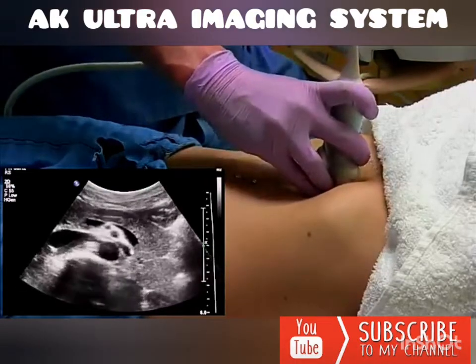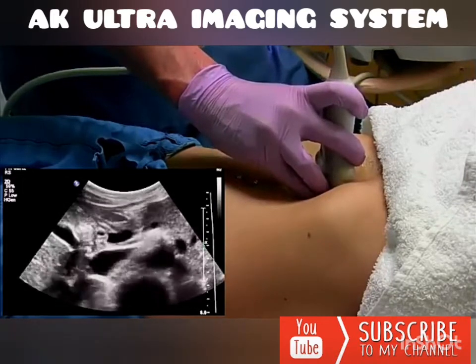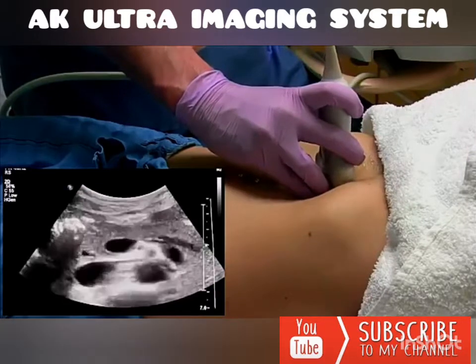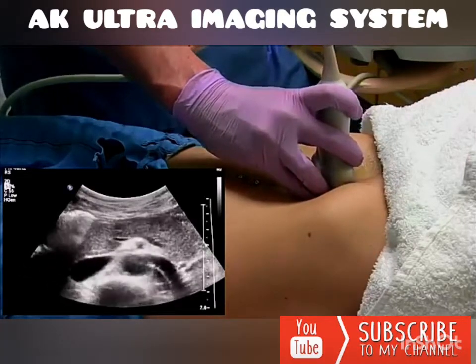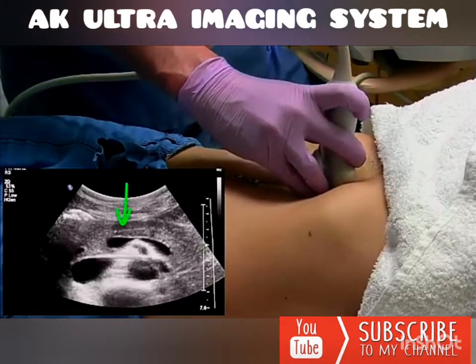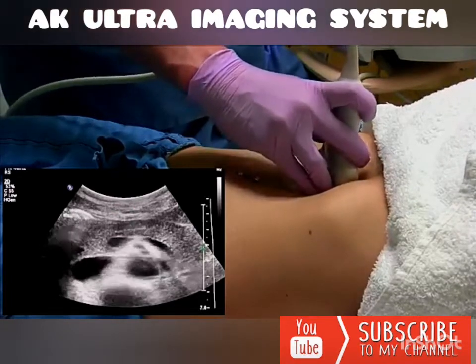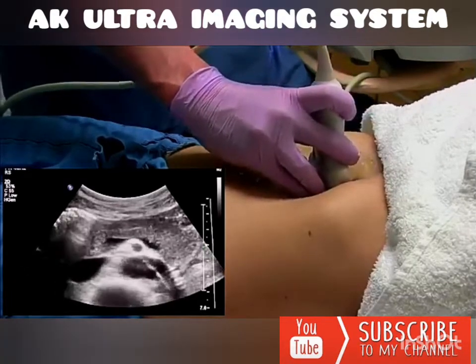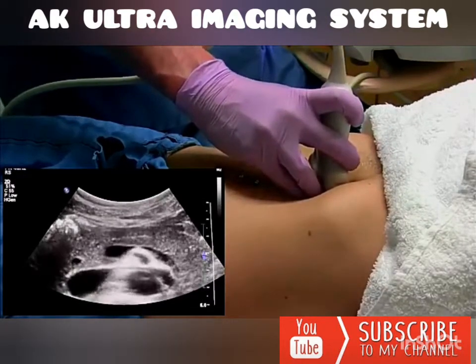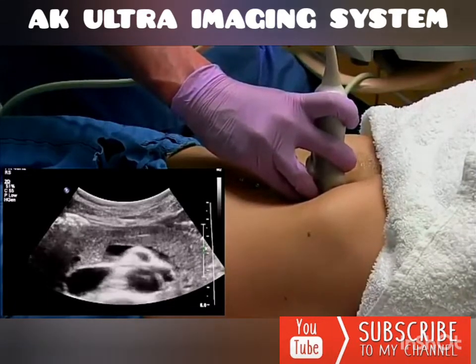When you're looking at the pancreas, you want to look for certain structures as well. One of the structures we can look for is the pancreatic duct, and that runs right through the body of the pancreas, throughout the entire length of the pancreas. In a lot of patients, you will be able to see the pancreatic duct, and we usually use 2 millimeters as a cutoff for our normal pancreatic duct measurement.